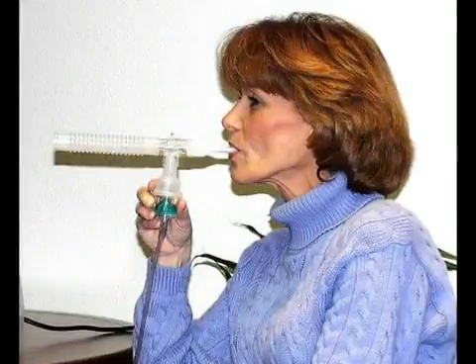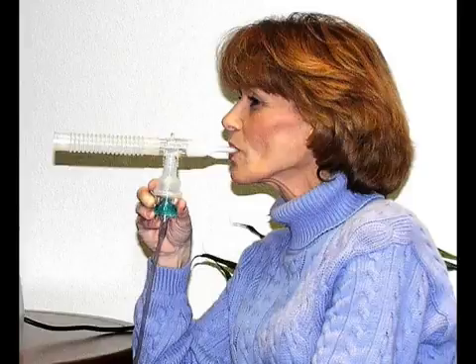Breathe through your mouth, not your nose. This will get the medication deep into your lungs where it can do the most good. Take 2 or 3 slow, deep breaths between normal breaths. Continue this until there is no liquid remaining in the medication cup.